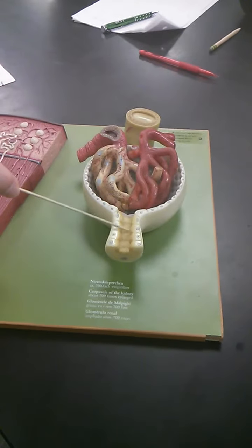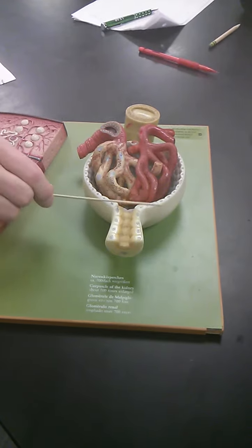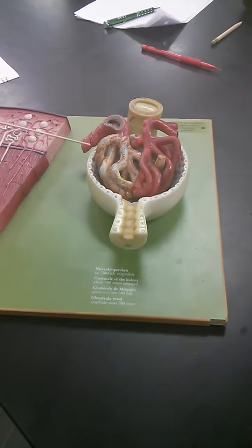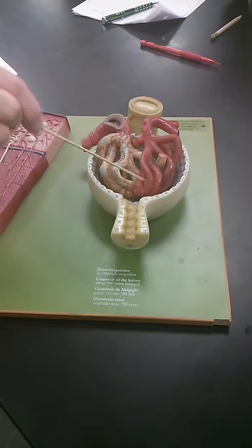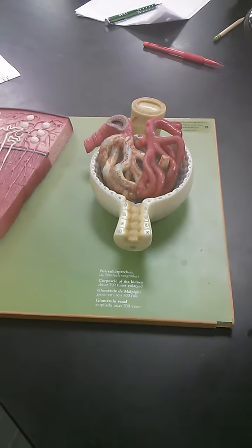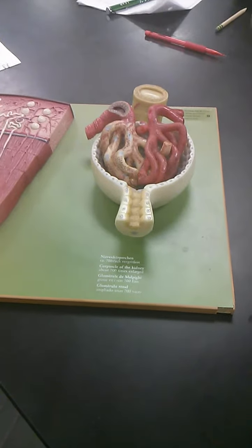villi, which increase the surface area for absorption right here. And a lot of absorption occurs right here. Okay. Here is your afferent arteriole. It's nice, big, and fat. Comes in, and then the efferent arteriole goes out. That's it on that. Glomerulus.